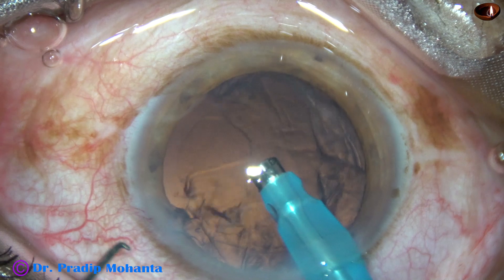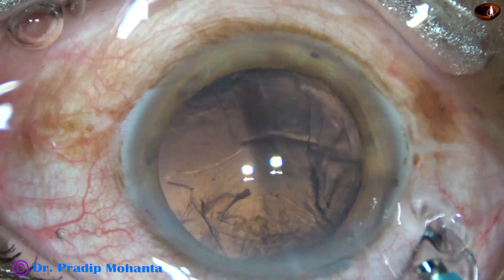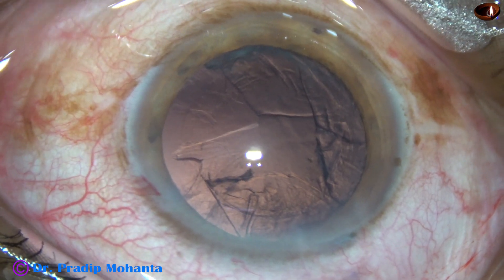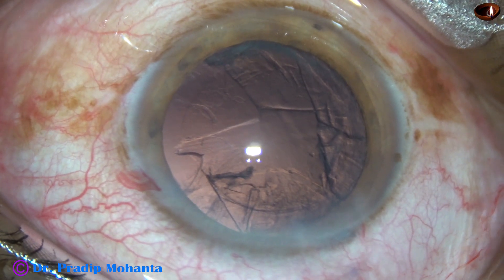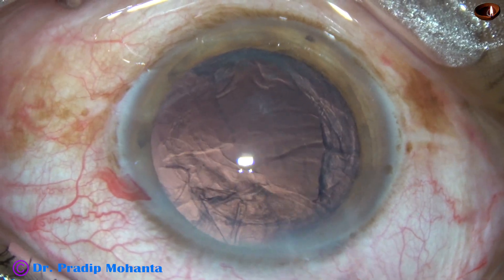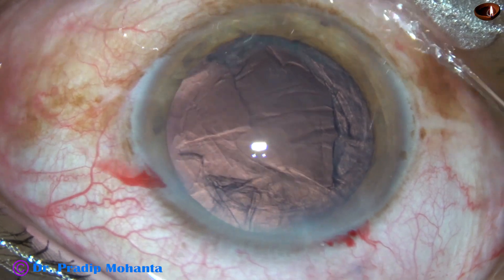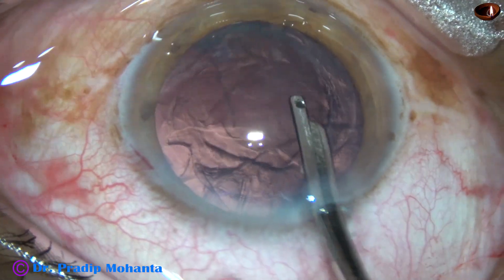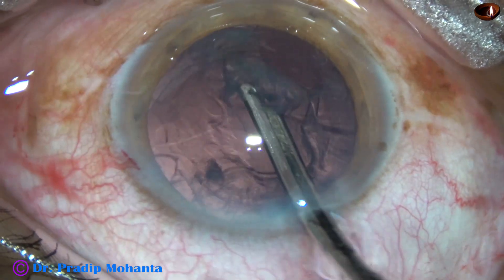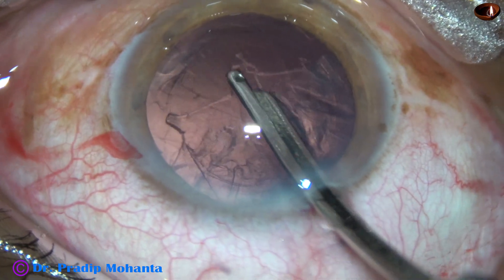So, in no time, the nucleus and epinucleus are out. The tip of the FACO needle has always been at the iris plane, and there has always been a gap between the endothelium and the lens mass. So it is a very safe technique.